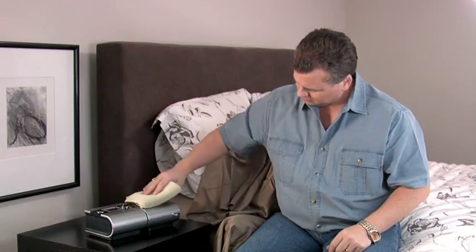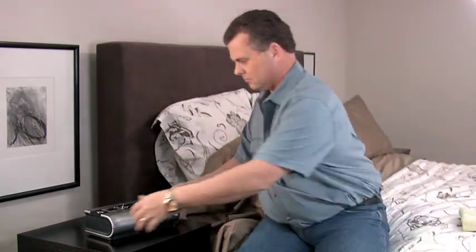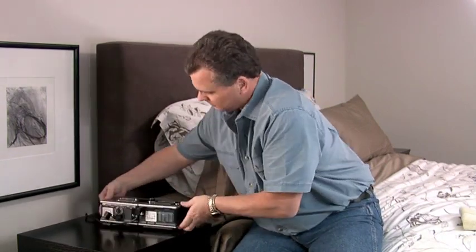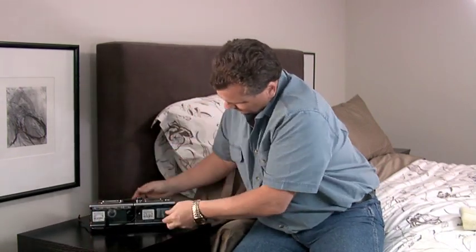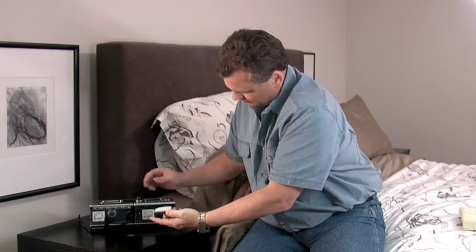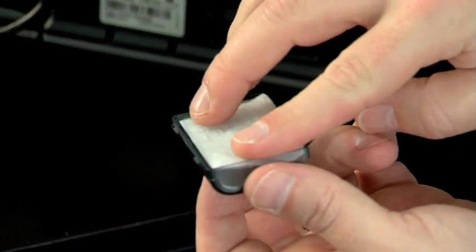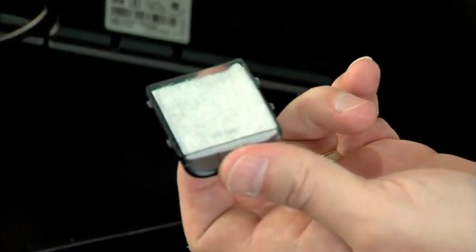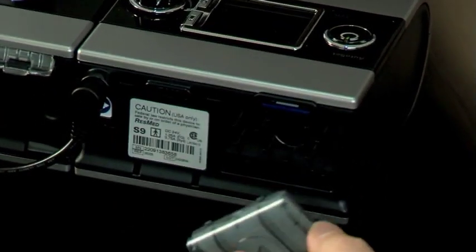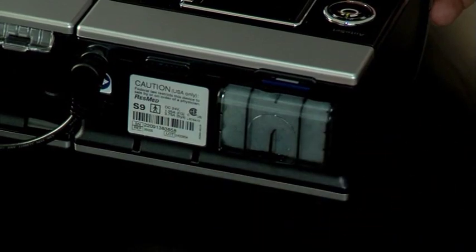On a monthly basis, wipe the exterior of your system with a damp cloth and mild detergent. Check the air filter for holes and blockage by dirt or dust. Replace the filter periodically, at least every six months. Remove the old filter from the device and throw it away. Insert the new filter, making sure it's sitting flat in the air filter cover. Then replace the air filter cover.